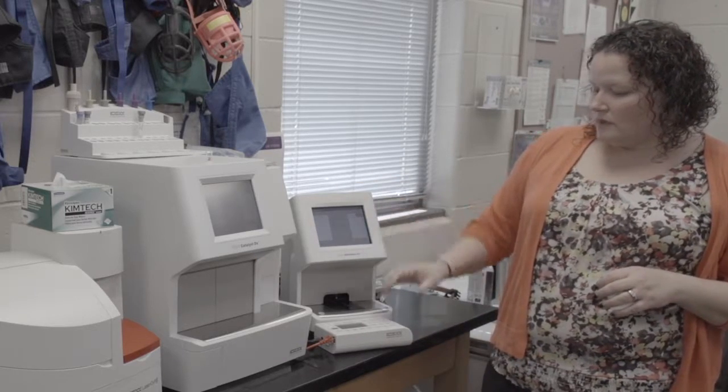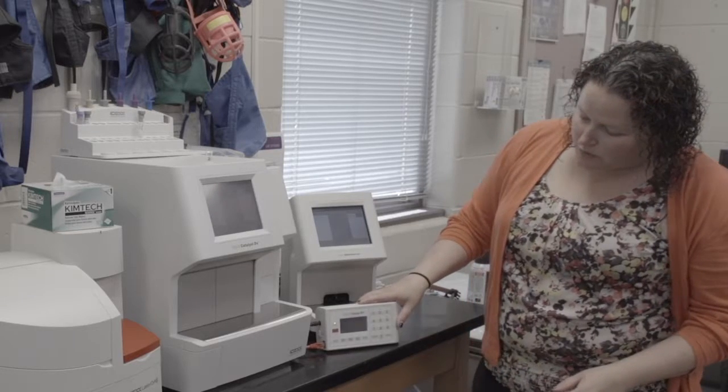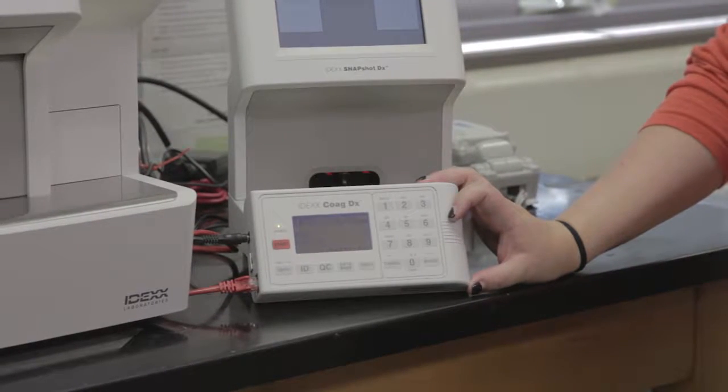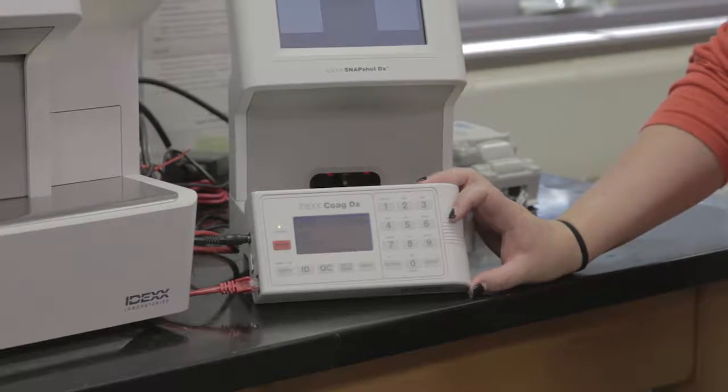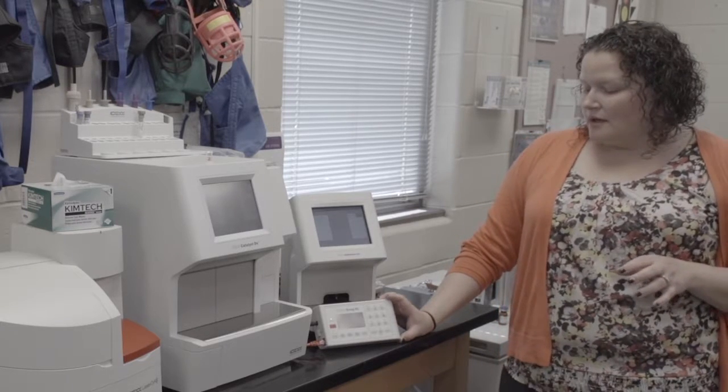Okay. So lastly, we have our coag. So the coag analyzer is what's going to run your clotting time. So that will run your PT and your PTT. This runs on cartridges. You have some options, but I'm going to recommend that you only ever run the sodium citrate cartridges. You can run sodium citrate cartridges or whole blood cartridges. Most of my clinics only ever carry the sodium citrate cartridges.